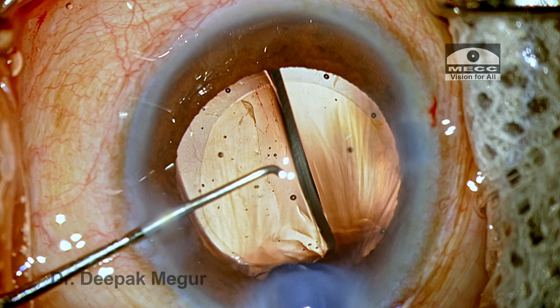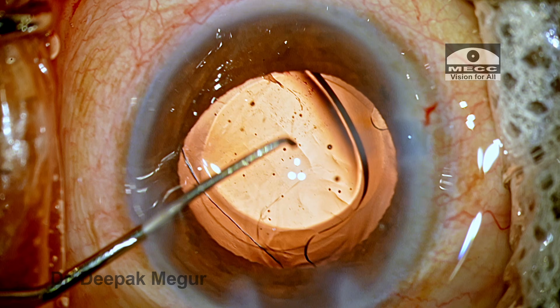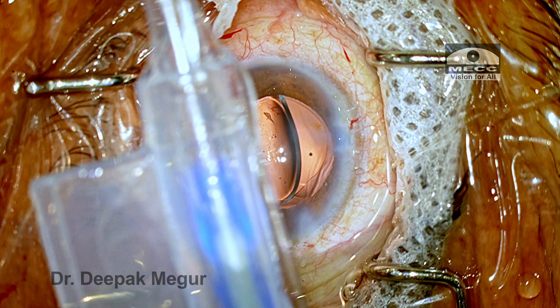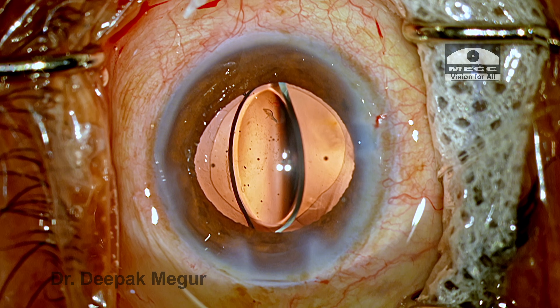This is a situation which most phacoemulsification surgeons are likely to experience in their professional career. The cause might be anything, the most common being improper loading. However, it's a situation where most surgeons have to be prepared for. So let's try to go step by step on how to manage such a situation.